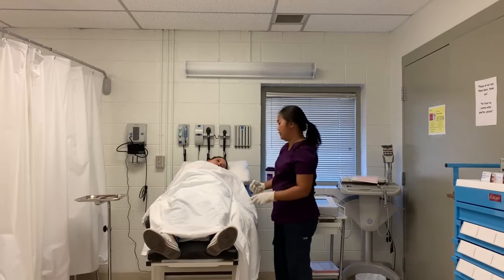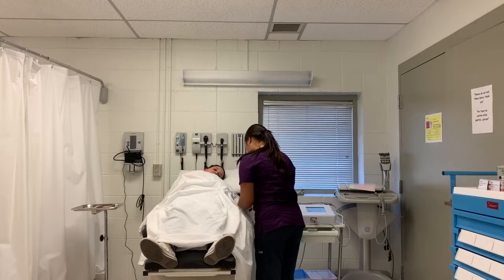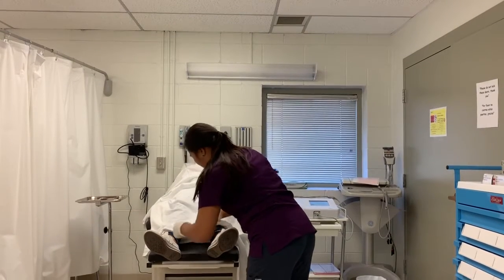I'm going to start with the limbs. Legs.